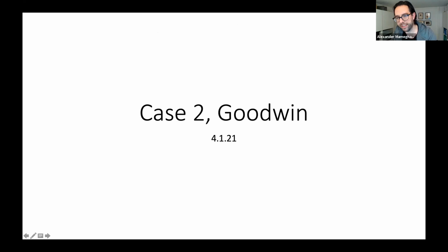And this is the 3-year follow-up in 2019. You see the date up there, and this is 3 years later. What I did was just decompression and fusion, long segment fusion. I was not able to go to T2, so I made this weird cerclage with 1 millimeter cerclage as a solution, because I didn't want to use just two screws in C3. I'm so sorry, Alex, I think we changed the screens already.